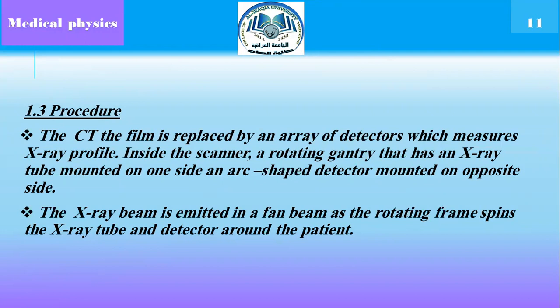The X-ray beam is emitted in a fan beam as the rotating frame spins the X-ray tube and detector around the patient.